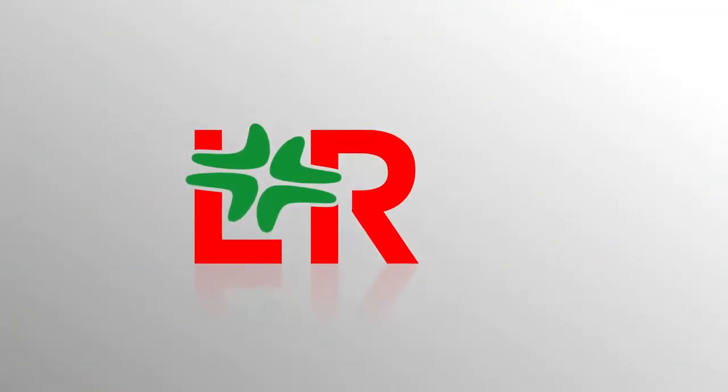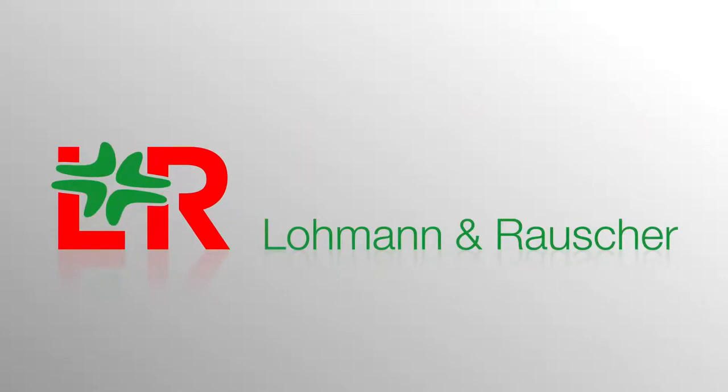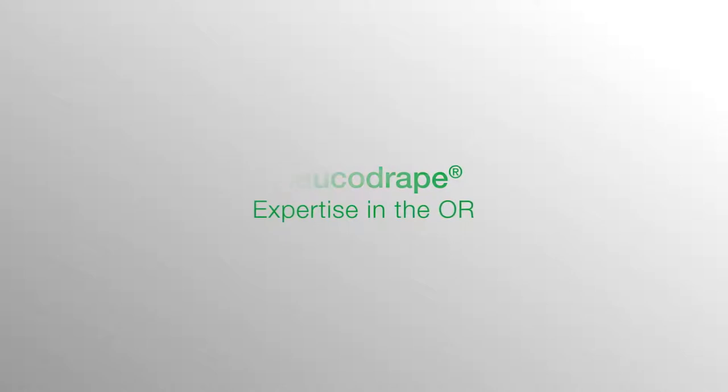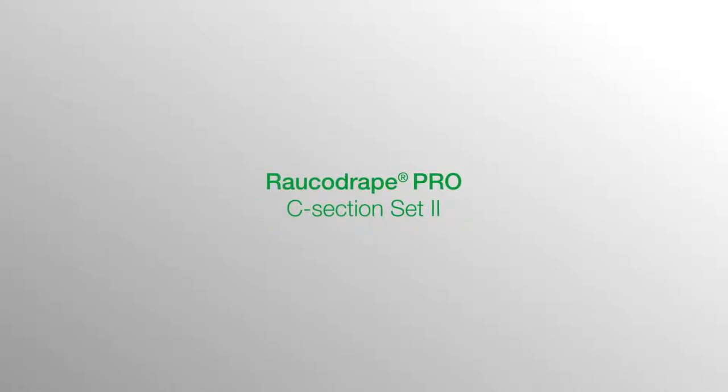The international corporate group L&R develops, produces and distributes premium medical devices and treatment solutions. L&R's Rauco drape products are synonymous with safety in the OR for users and patients. We hope you enjoy our user video.